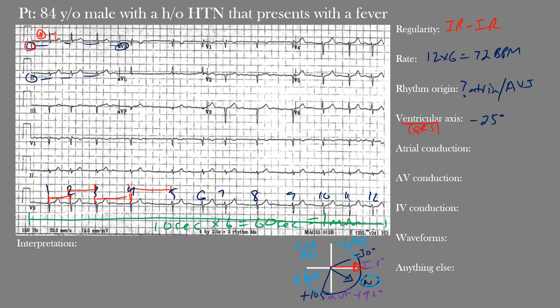Looking at lead I, we see mostly positive upright complexes — so lead I heads toward its positive end. Looking at lead AVF, we have mostly negative complexes, meaning we're going away from the positive end of AVF. That puts us somewhere in the left axis region. Note that physiologic left axis deviation (still normal) is one region, while pathological left axis deviation is beyond negative 30 degrees, so we need to look at another lead — lead II.